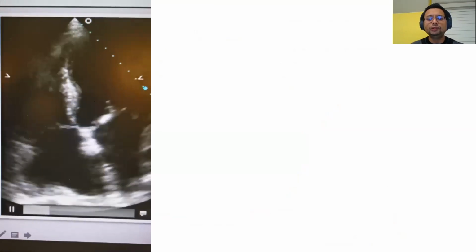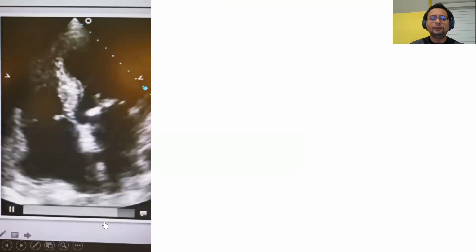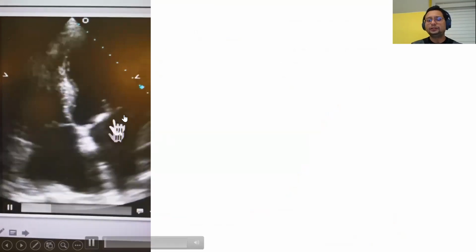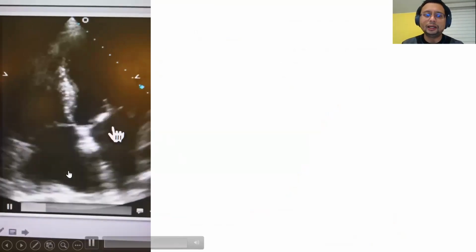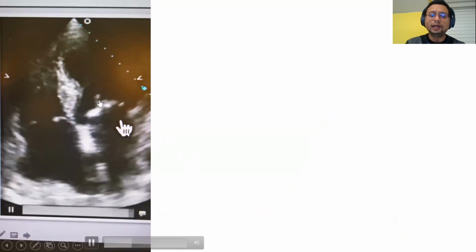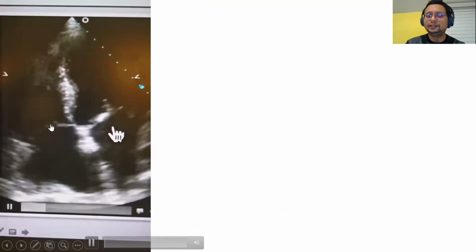So just the first echocardiogram for you to see today. All right, so this is actually someone that has rheumatic tricuspid stenosis. Okay, so this is actually a Mayo format. So I forgot to label here. So in Mayo Clinic, and I will tell you whenever I'm showing echo from Mayo format, the right ventricle is actually here on the left side of your screen, and the left ventricle is actually here.